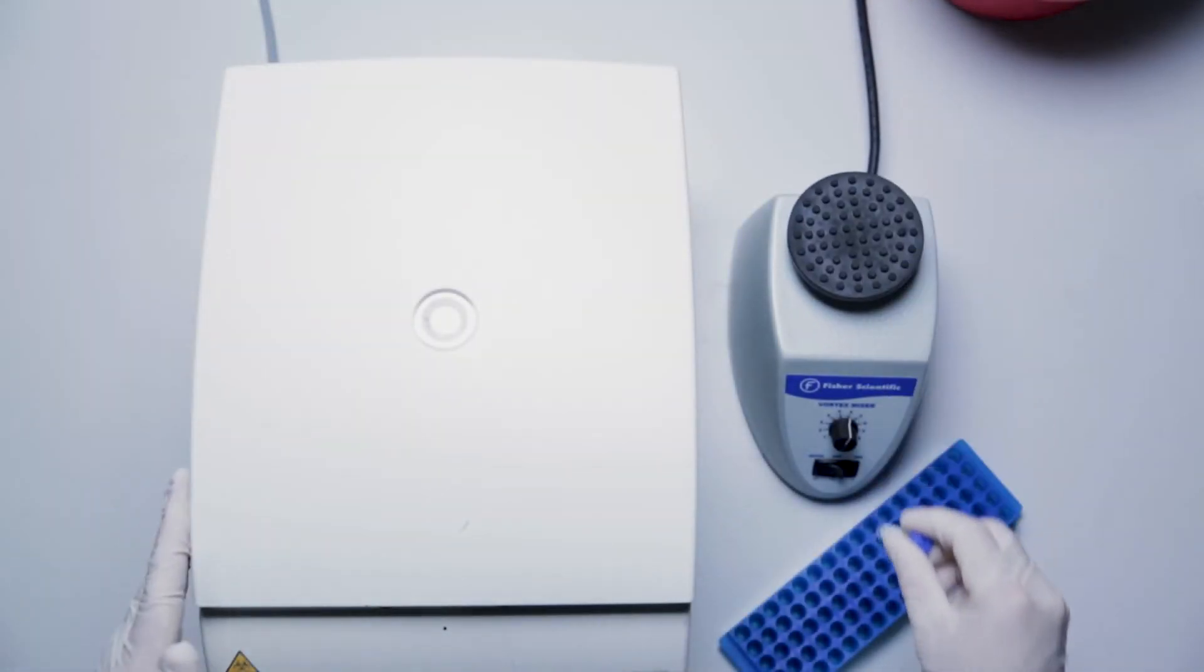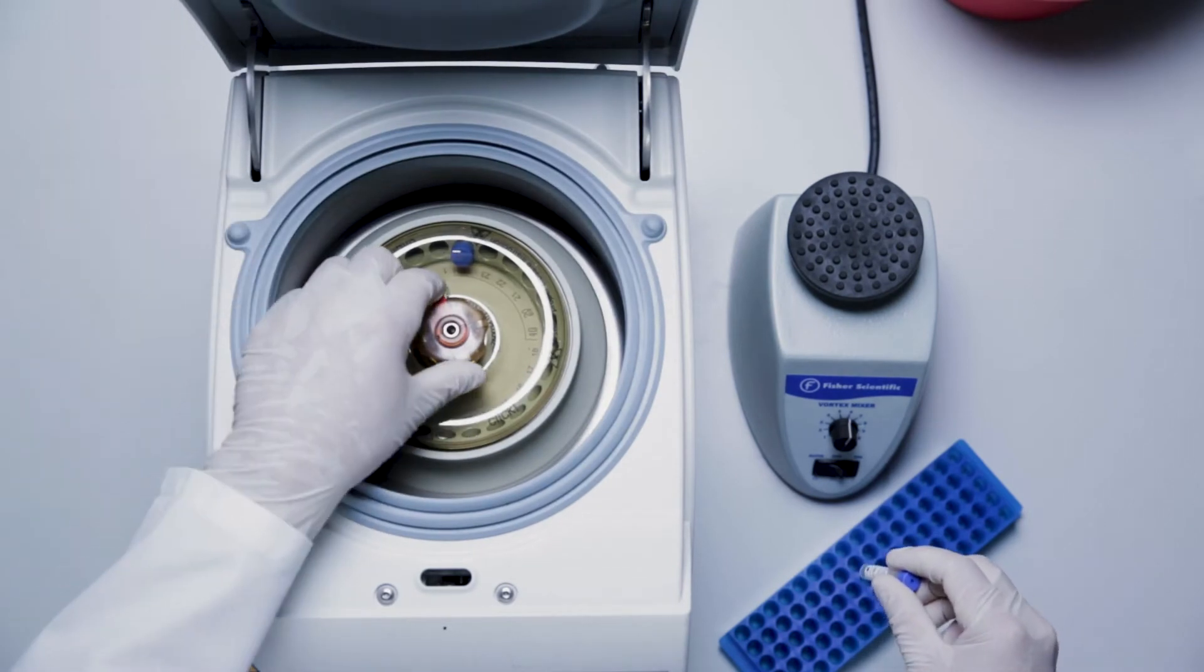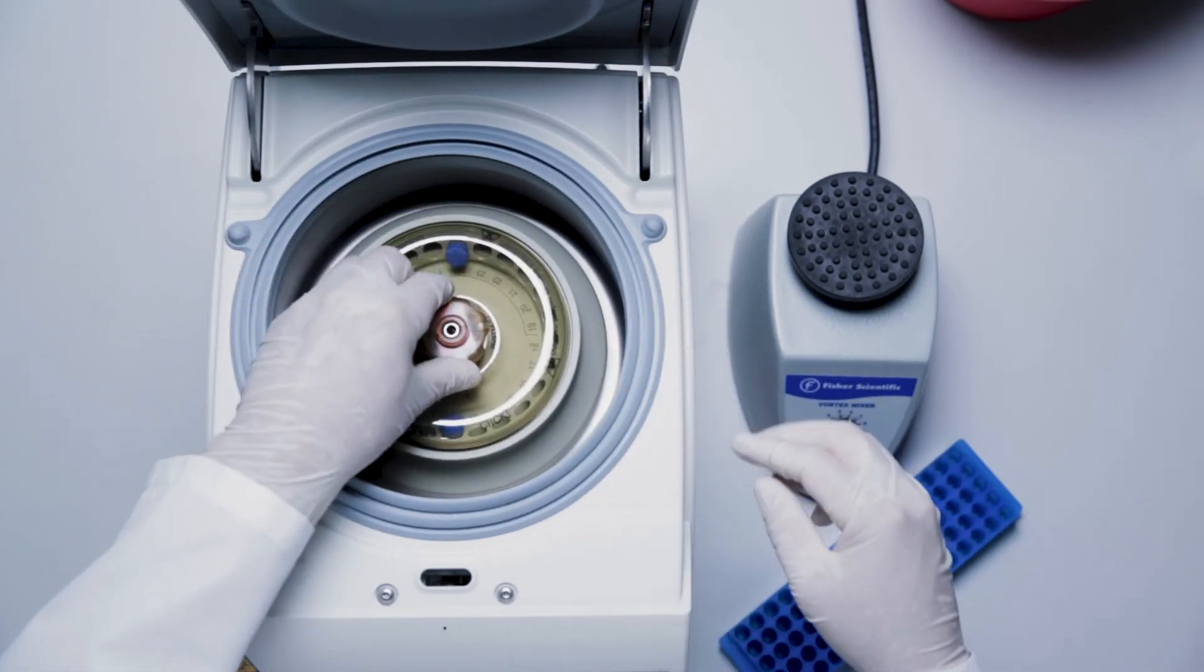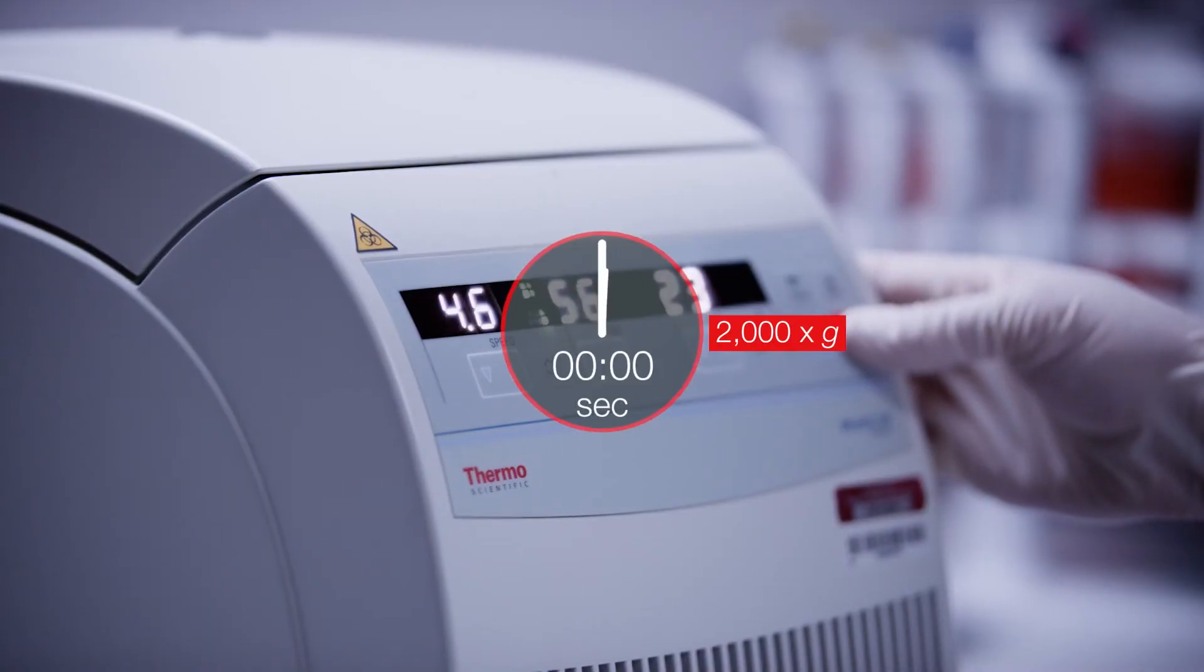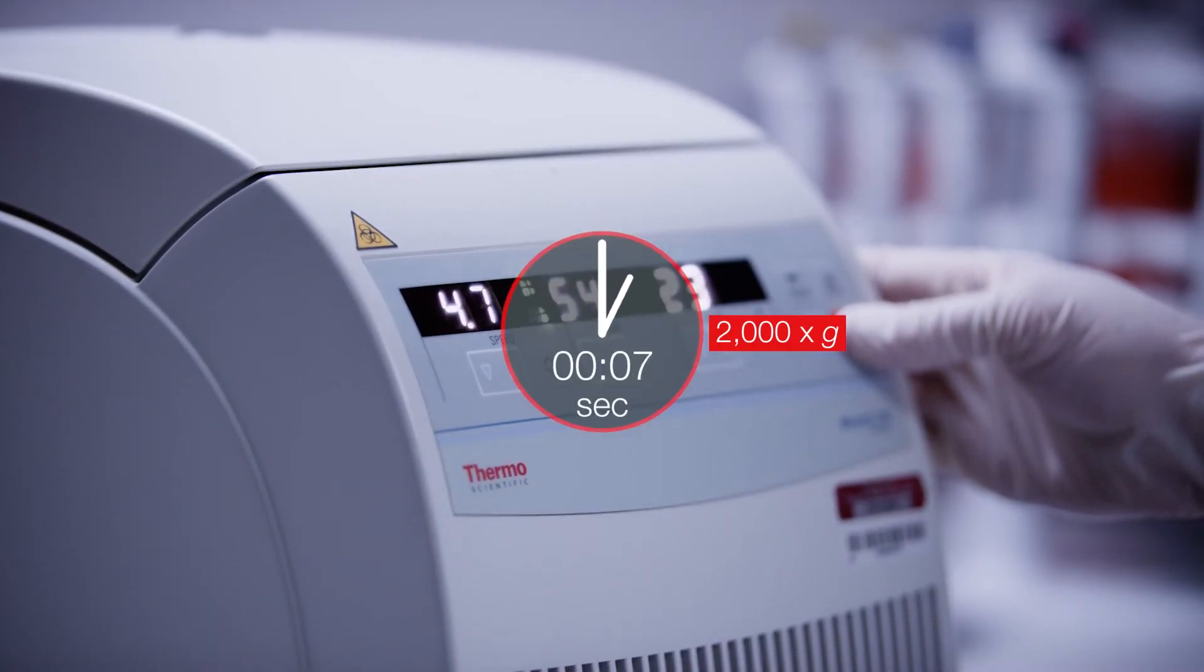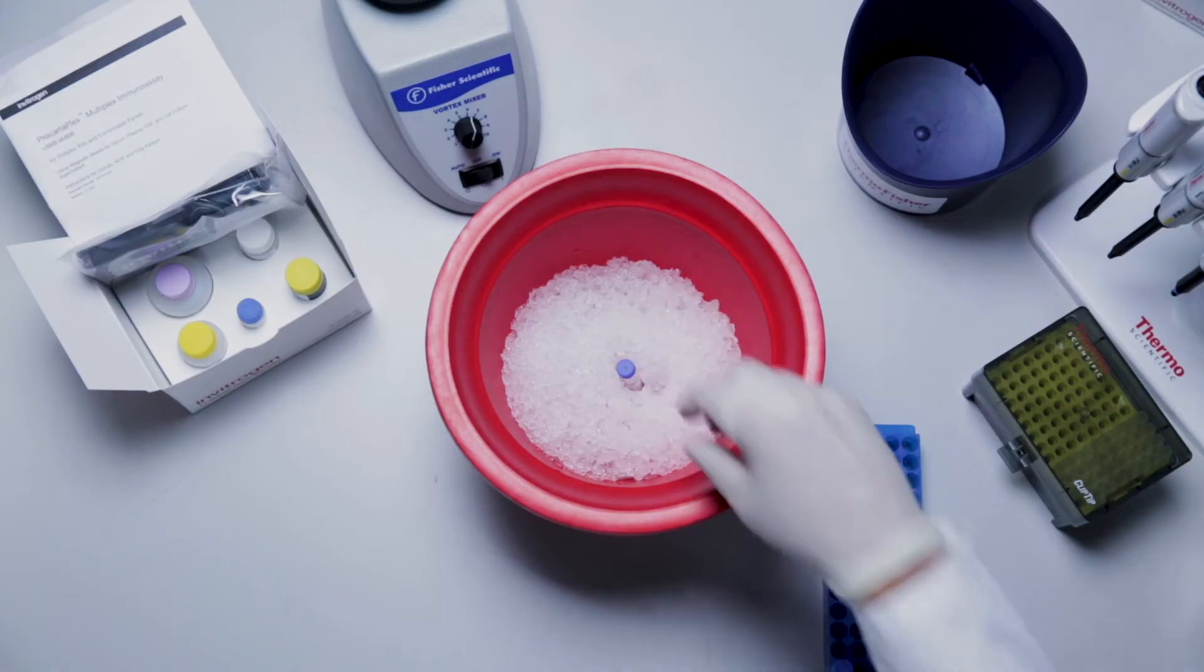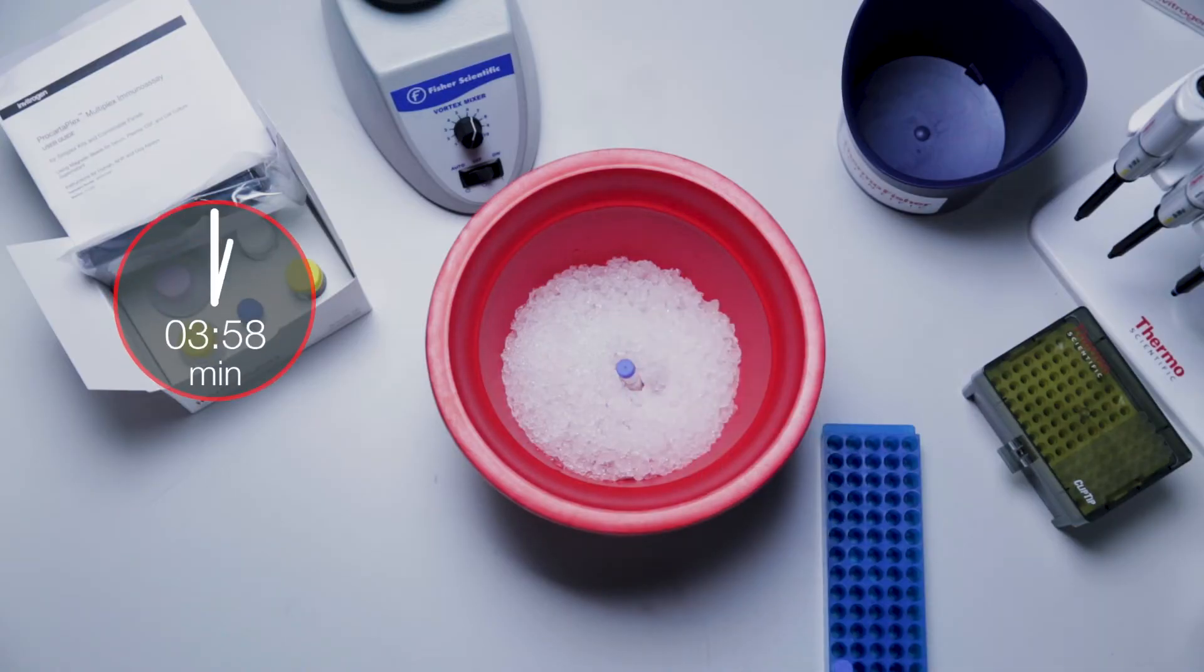Vortex the sixth standard vial at high speed and then centrifuge at 2000 g for 10 seconds to collect contents at the bottom of the vial. Incubate on ice for 10 minutes to ensure complete reconstitution.